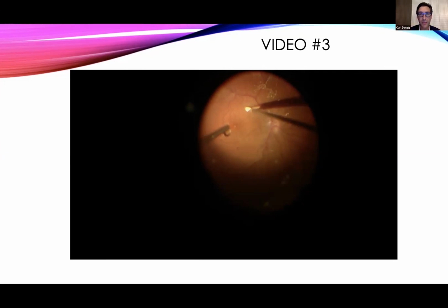Right. If someone asks me, hey, I'm just nervous. We see something that gets FDA approved or something that doesn't get FDA approved, and we're worried about inflammation. It's a hot topic now for good reason in the retina community. And then they say, well, this staining dye was approved in December 2019, and I'm hesitant to implement it in my armamentarium in the operating room just because I'm worried about safety.